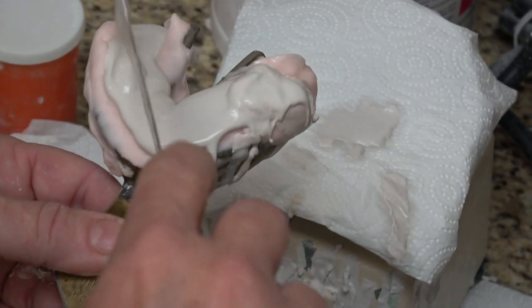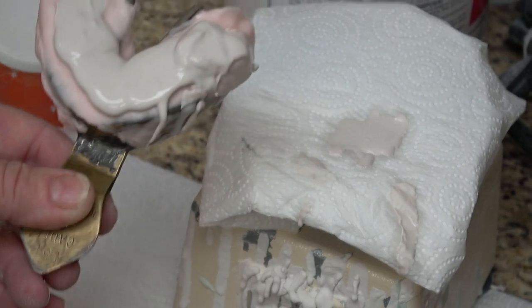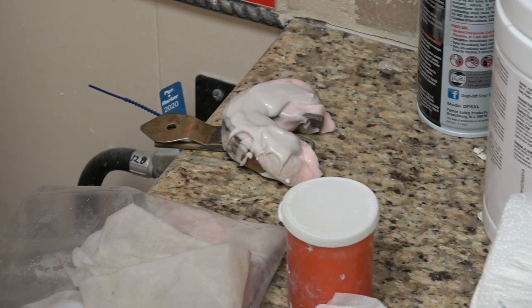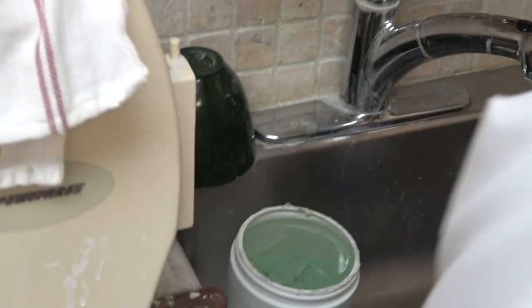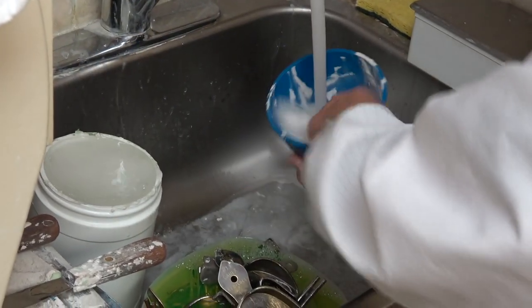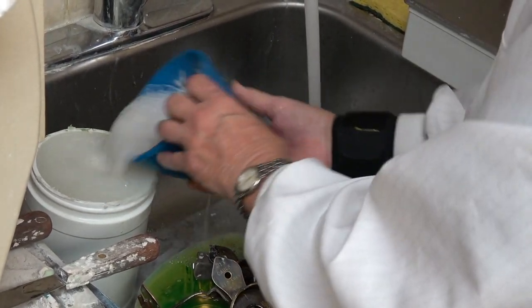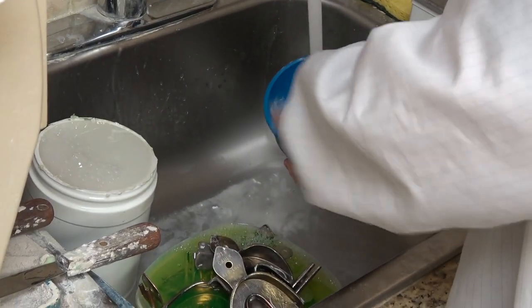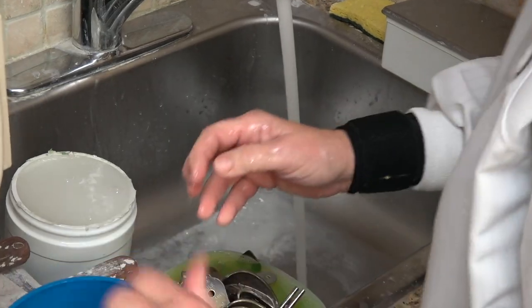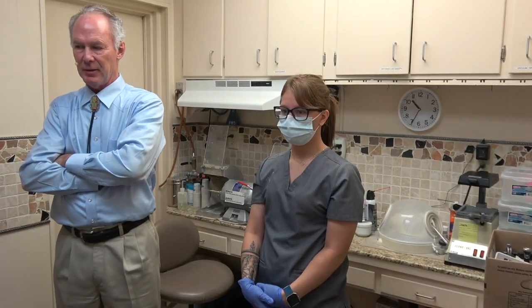Pam's been doing this for 45 years, so she's just about getting the hang of it. Then you're ready for it to set. When rinsing out your bowl, be sure you have something for it to go in, and have a plaster trap under your sink to catch the plaster — or else you'll stop up your sink.